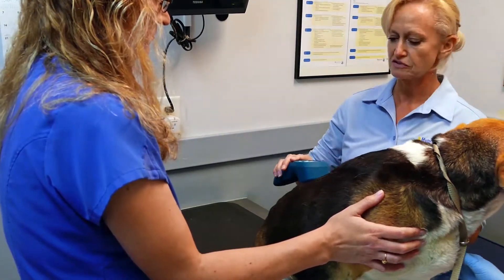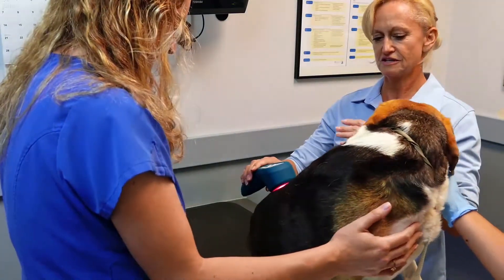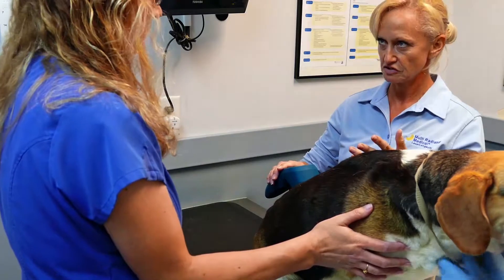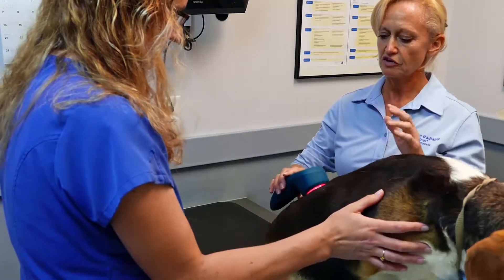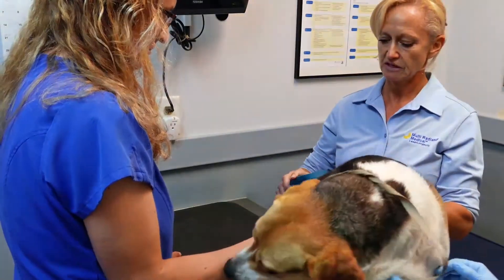You would never do stimulatory and inhibitory treatments in the same place at the same time, because one will cancel out the other — you'd be defeating the purpose. One stimulates the cells, gets them active, kicking out the ATP, nitric oxide, oxygen, so they all start boogying around, reproducing themselves, healing. The inhibitory doses are a lot heavier, but they actually shut everything down — they switch the cells off, hence shutting off the pain. So if you go somewhere with a stimulatory setting and then go right over top of it with an inhibitory, the cells are going to go: you don't know what you want, so I'm just going to do nothing. So it cancels itself out.